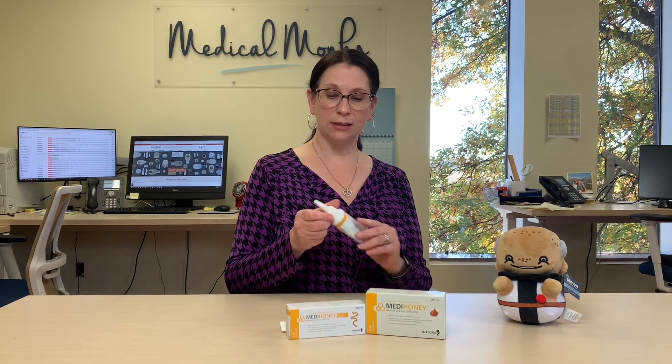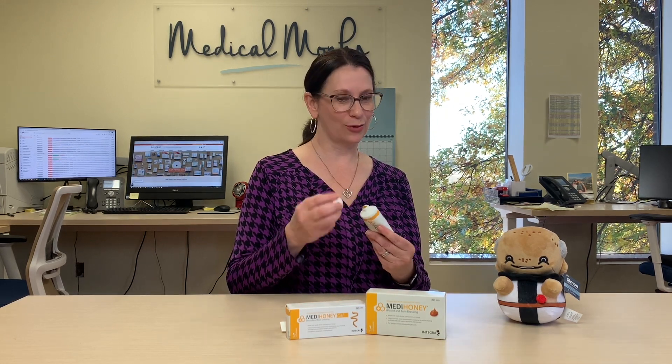You can apply it to a venous fascious ulcer, any type of ulceration on your feet, anywhere. Burns — first and second degree burns, donor sites — it treats all of these. It has so much use. And everybody has a question like, what does it taste like? It tastes like honey. It really does.